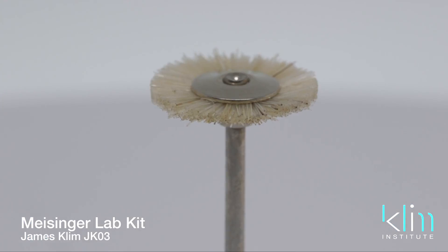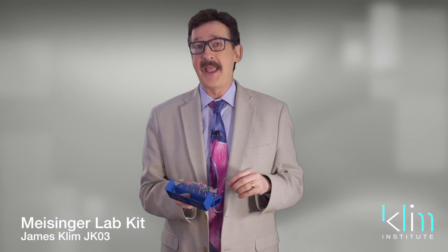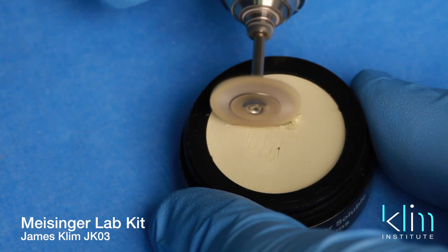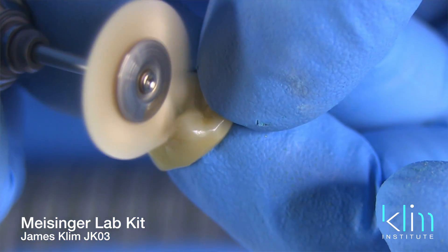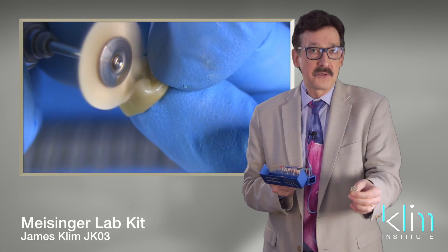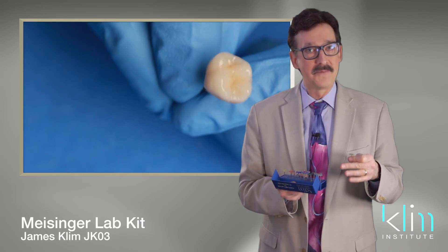Last but not least, the final polishing asset on our kit is a horse hair Robinson wheel. We want to thank all the horses who donate their hair for our polishing effects. I do like a coarse one when using diamond paste with a coarse wheel. When you use a low RPM with good torque on your handpiece and plunge the bristles into a central groove area, it's a plunge and release action. On an occlusal table, as those coarse bristles are released from the surface, it will polish to the very depths of your grooves.